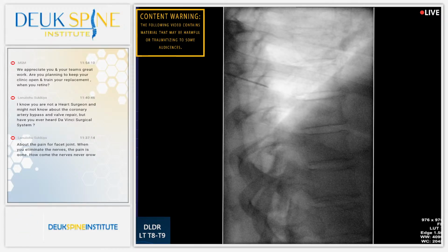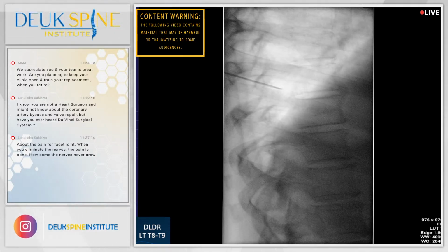This might be it. We'll see. If I can just get around that rib head. That's looking a little bit better. AP.